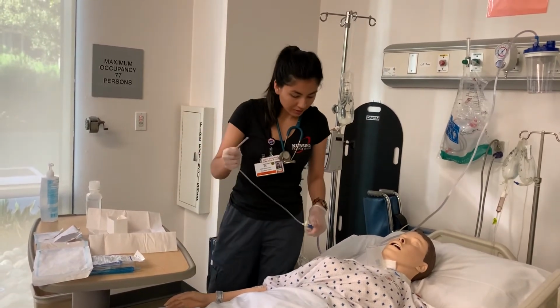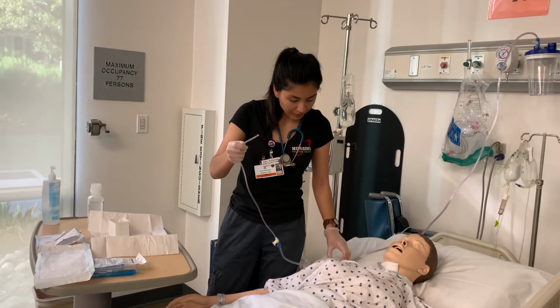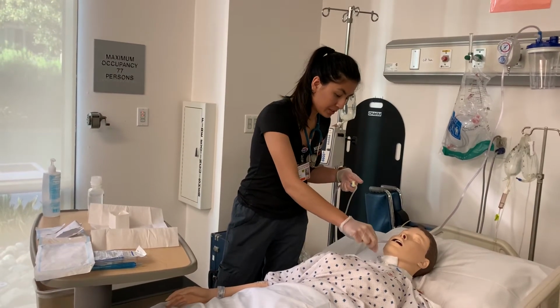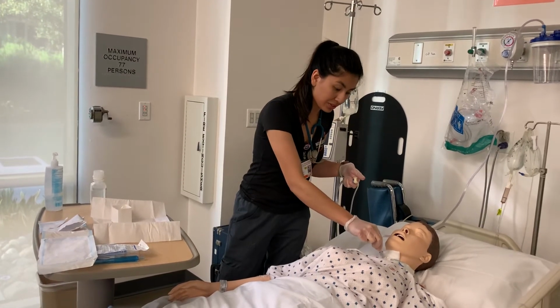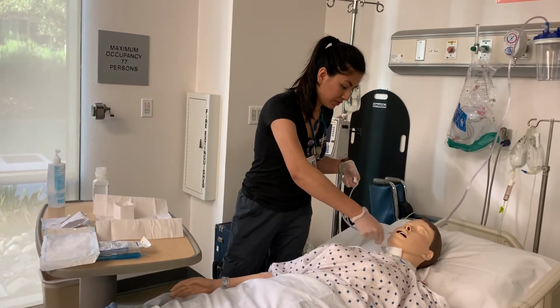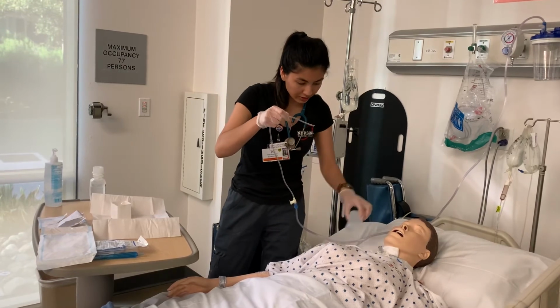All right, Jane, so I'm going to loosen the cap, or take the cap off. And then I'm not going to suction, I'm going to insert until I feel resistance. And then she'll either cough, or if she doesn't cough, I'll ask her to cough. And I would pull out 1 centimeter, and then I'd start suctioning intermittently for no more than 10 to 15 seconds. And then once that's done, I cover her again.